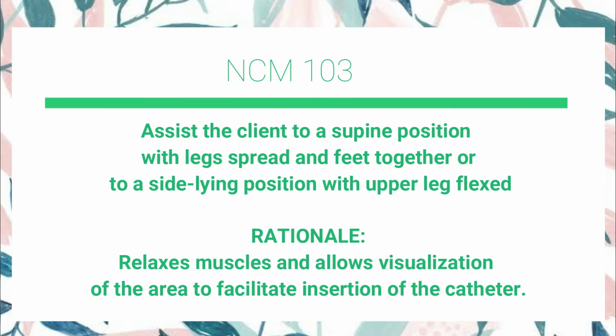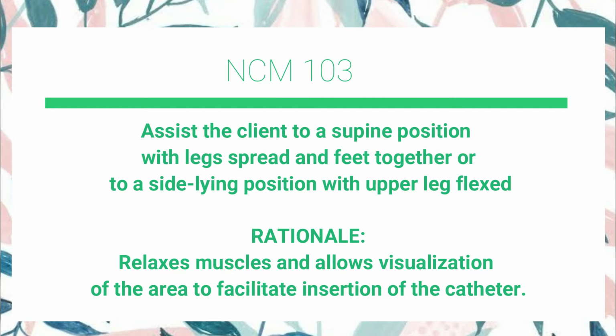Assist the client to a supine position with legs spread and feet together, or to a side-lying position with upper leg flexed. It relaxes muscles and allows visualization of the area to facilitate insertion of the catheter.